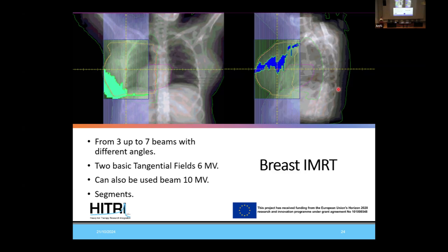Here in the IMRT and after that the VMAT is the inverse planning. What does that mean? Inverse planning, so we are telling the system, try to protect this, try to irradiate this, and calculate me the beams, calculate me the time, calculate me the dose, and I'm just checking the results. It's difficult, but always the decision on what I'm going to do depends on the physicist or the appropriate dosimetrist.